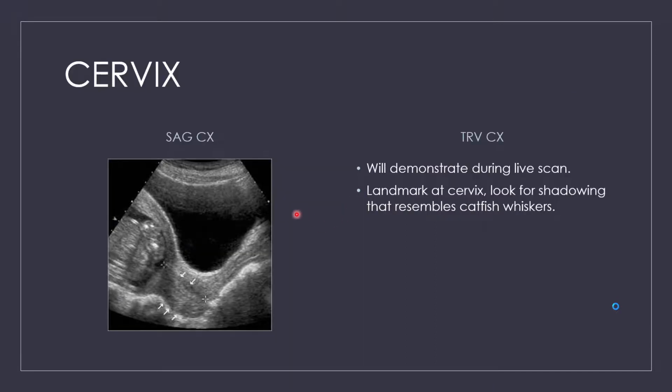Okay, now sagittal. This is the cervix in a sagittal plane. This is a patient that's pregnant because we've got a baby here. I can't see much of it, but I would guess this is definitely into the second trimester. This is a bladder. It's got a pretty good amount of fluid in it. Here's the vaginal canal, and then this is the cervix.